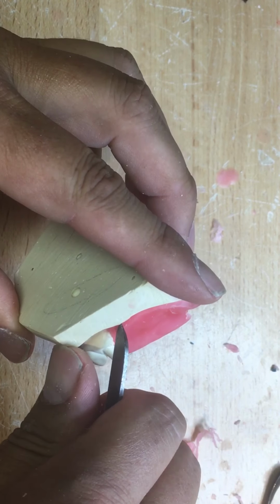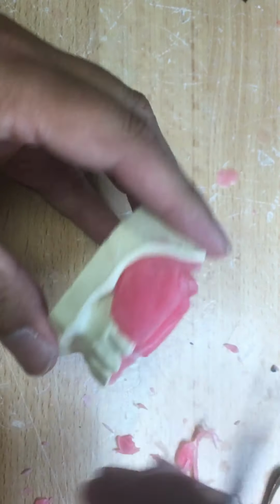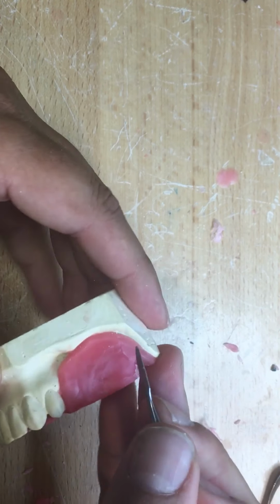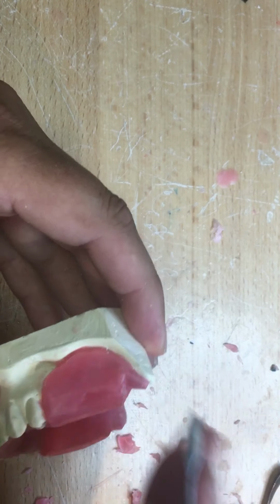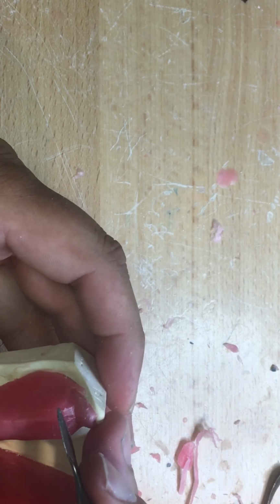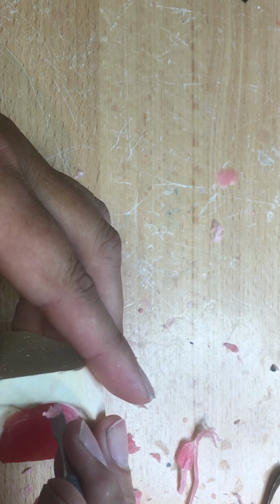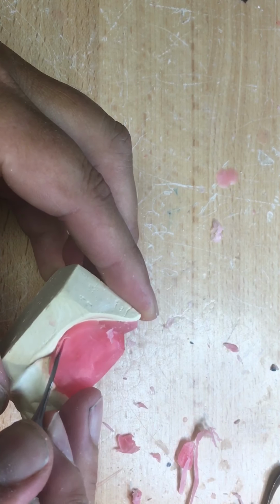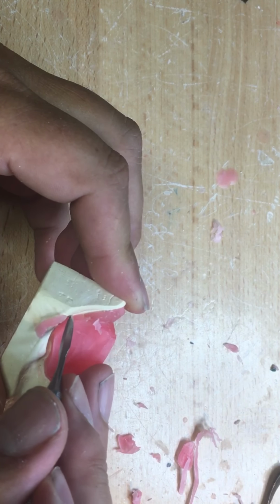Try not to scratch the model, scrape the model, chip the teeth, scrape the teeth, abrade the model, right? Keep the model clean. If you get any wax that's going to stay on there that you can't scrape off, then steam it off with the steamer or boil it off, because presentation is also very important in the dental laboratory. This is going to be presented to the patient chairside to be put in their mouth. You could use the analogy: you go to a restaurant, would you put a dirty fork in your mouth? No. Even one with spots doesn't look appealing to you. And that $40 entree might not be as appealing as is.